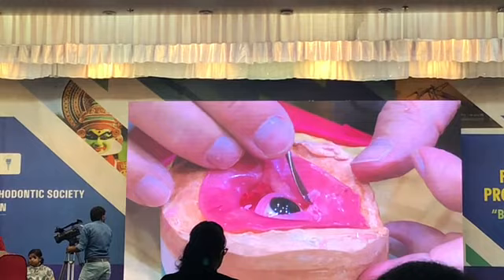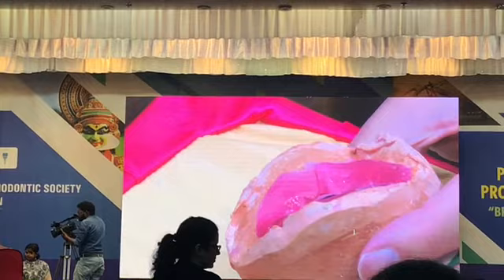Wax. When you have a little wax around it, it's easier actually to see it. That's why we do that.